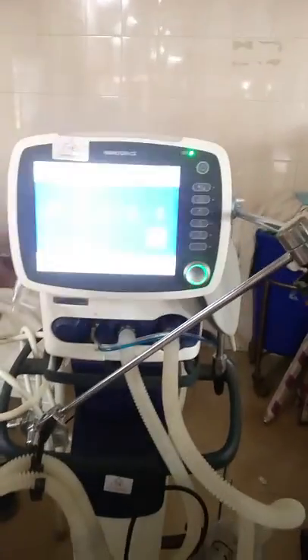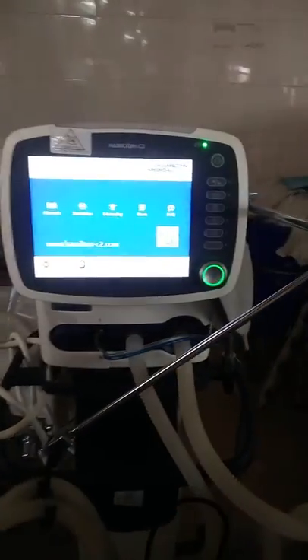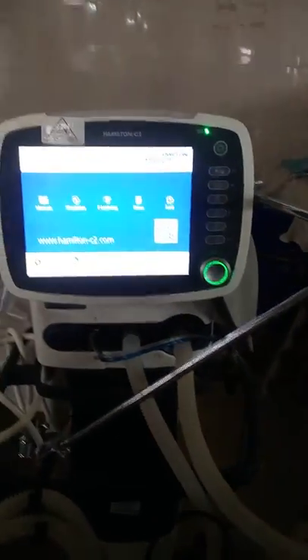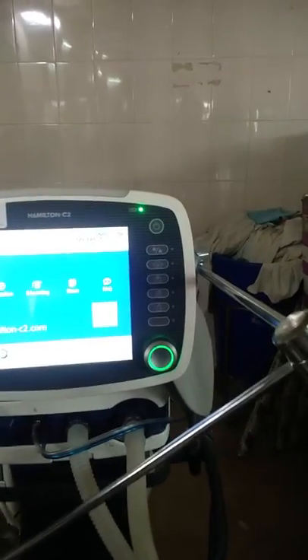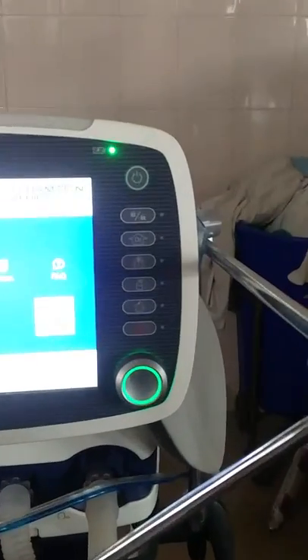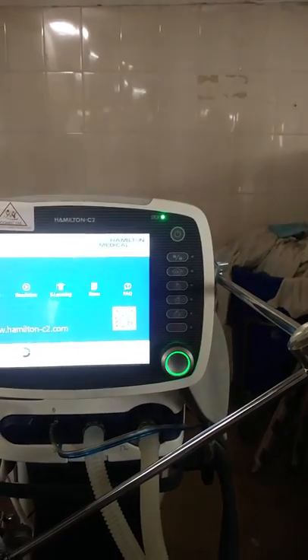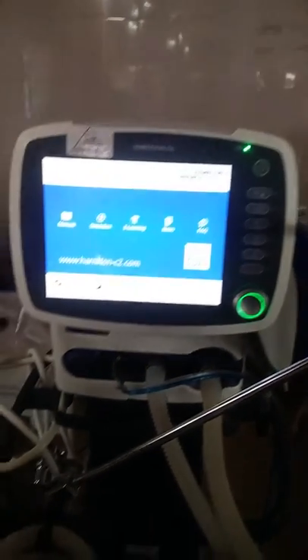How to use the Hamilton ventilator: press the on/switch button and keep pressing for three seconds. Self-testing will begin automatically. Wait for the self-test to finish.